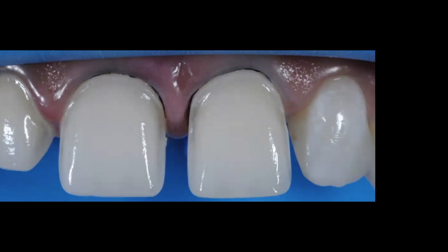Once you've saturated the etched enamel, take a new dry microbrush and start removing excess bonding agent from all the margins and the facial aspect of your preparations. Use two or three dry microbrushes — dry them on the patient's bib to check absorption. The first microbrush will absorb a lot of excess. When a second or third microbrush shows nothing more coming out, you know you've removed all the excess and achieved a very low film thickness.